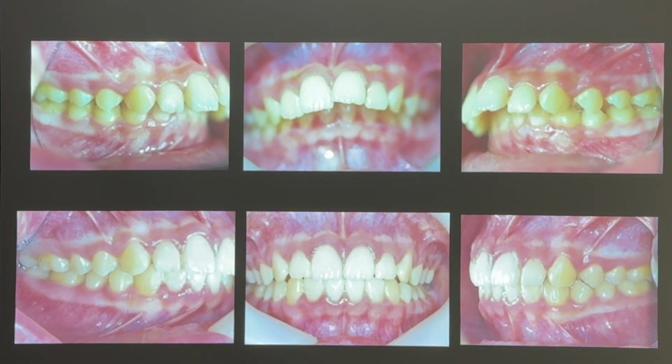But please don't forget that we cannot govern the muscle force with an orthodontic appliance. It means muscle habit. If a patient has some muscle habit and we don't control the muscle habit, huh?